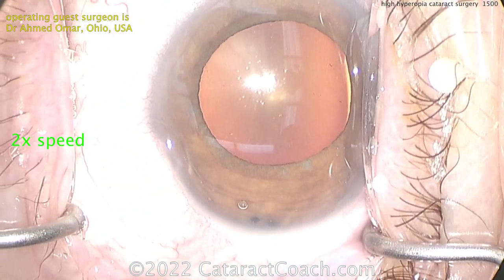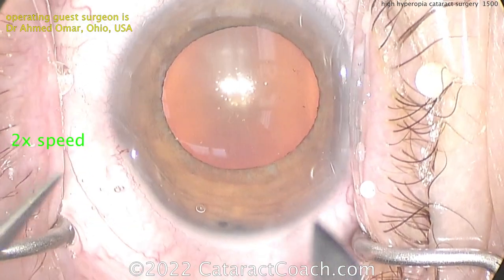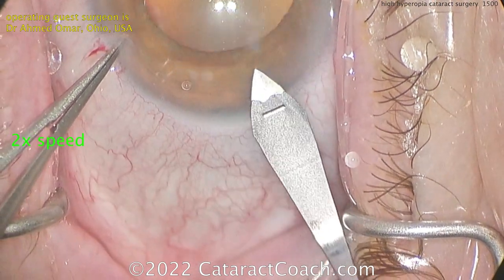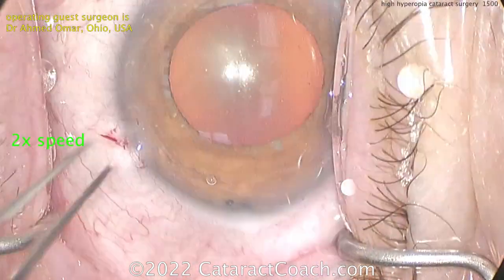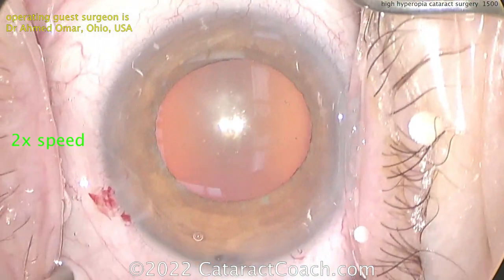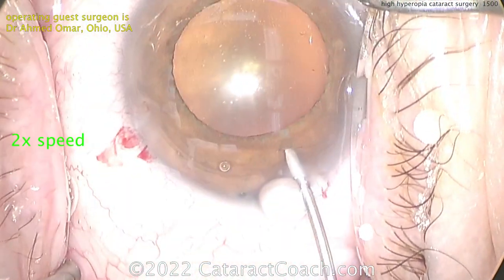He does a beautiful job, so I wanted to show you this case. He did calculate it on iolcalc.com, which is the lattice superformula. Now let's look at the incision. It's very important to get a good incision. Notice how the incision looks big in this eye — that's because the eye has a small white-to-white. It's a very small cornea, but this is a small eye.